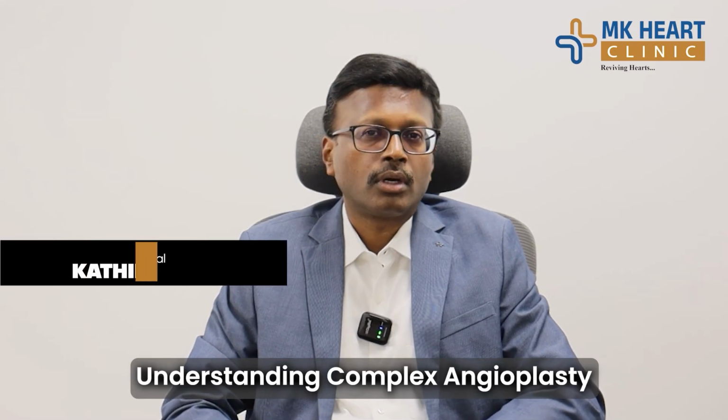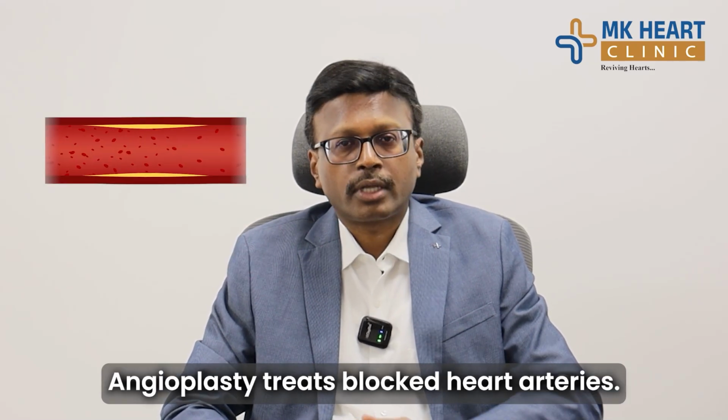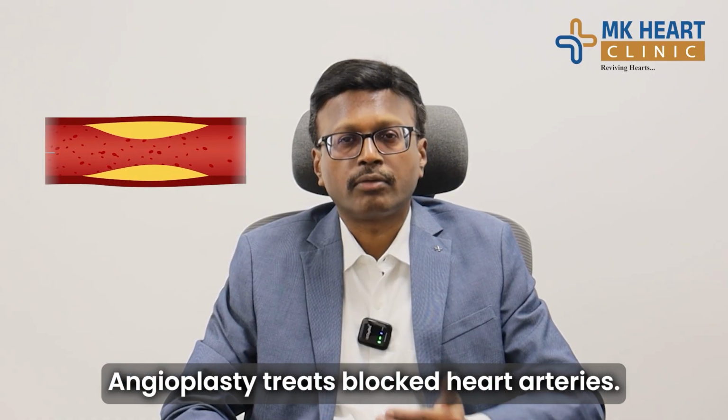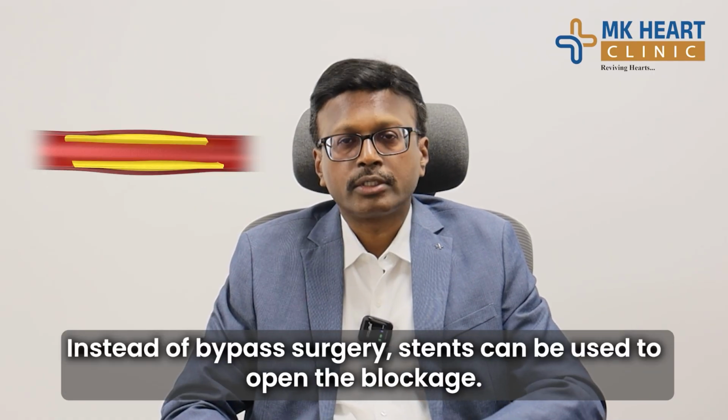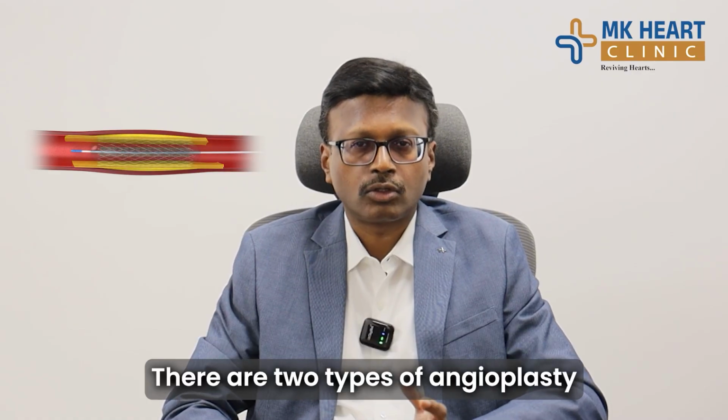So today we are going to have a nutshell view of complex or advanced angioplasty. Normally angioplasty is a treatment where some patients have a blockage in the blood vessels of the heart. So instead of bypass surgery, we are treating the blockages by implanting the stent. So this is called the angioplasty.